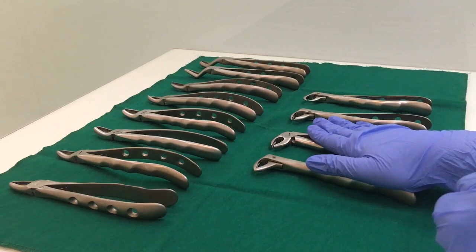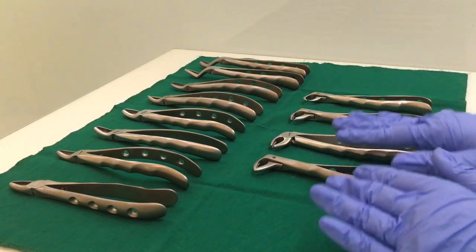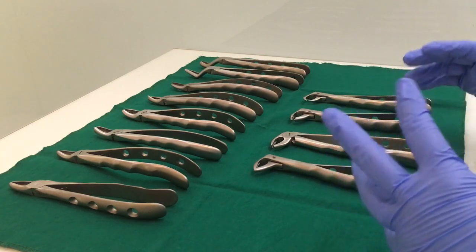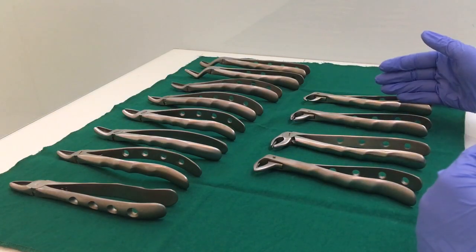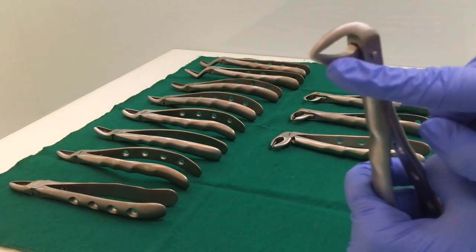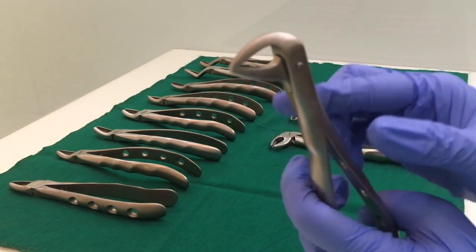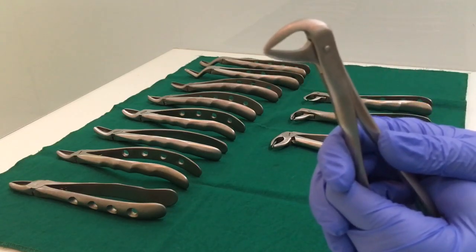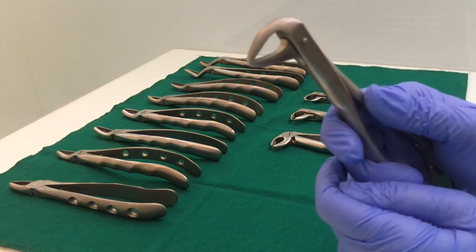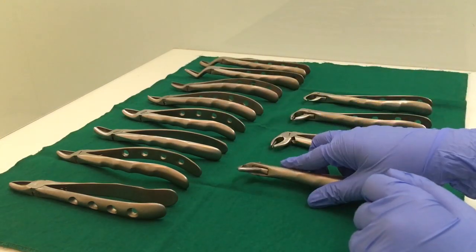Now we will move on to the lower dental extraction forceps. Unlike the upper ones, there are no sets of right and left extraction forceps in the lower ones, which makes identification pretty simple — there are only four of them. The lower anterior forcep has beaks that are closed — there is no gap in between the beaks. This is also known as lower root forceps because the same forceps is used for lower anterior teeth extraction as well as lower root extraction.